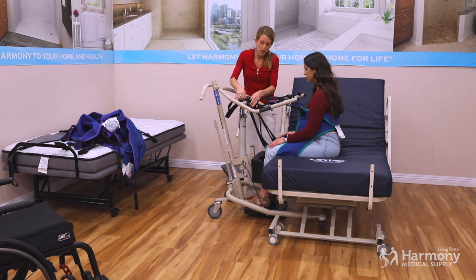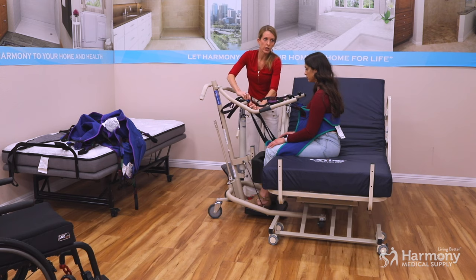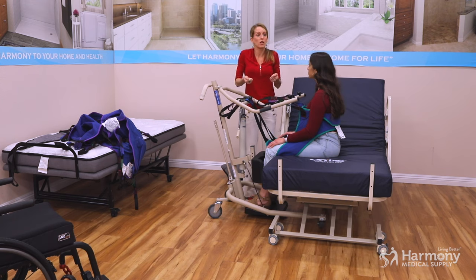We'll do a little bit shorter on the straps. When you shorten them, it's going to pull under the legs quicker and pull them up a little stronger, but it will also limit them standing all the way up because it's putting pressure underneath their leg.